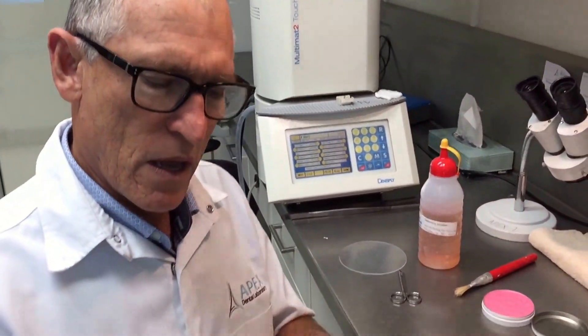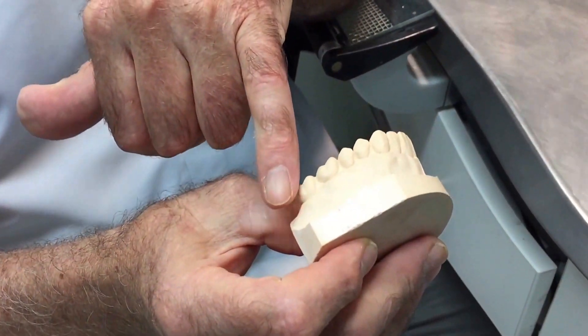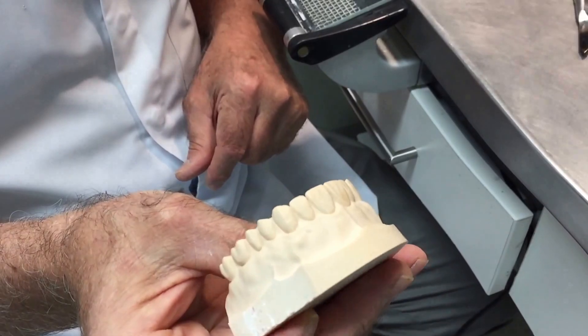I thought we'd run through the construction of a bleaching tray so that if patients are going to be bleaching their teeth, we minimize any side effects of the chemical. We're going to construct this in a manner such that you can reuse the model for other purposes. I've got a standard practice model here and we're going to pretend that this patient requires bleaching all the way around, just to get the idea of how to effectively apply the spacer.